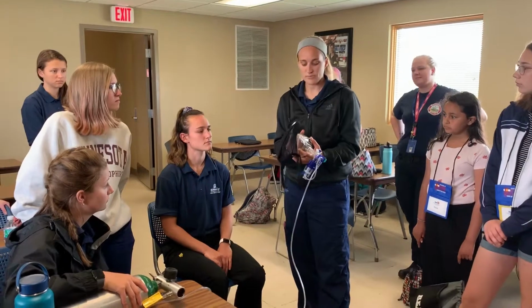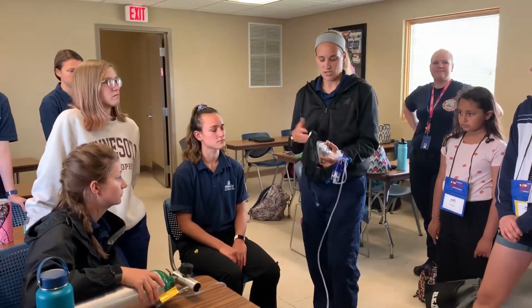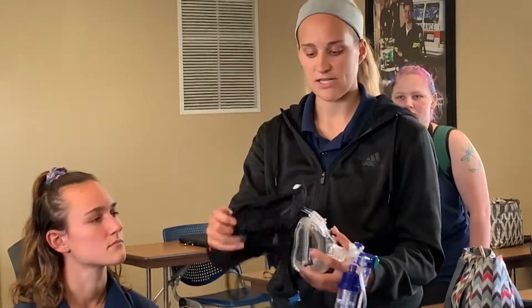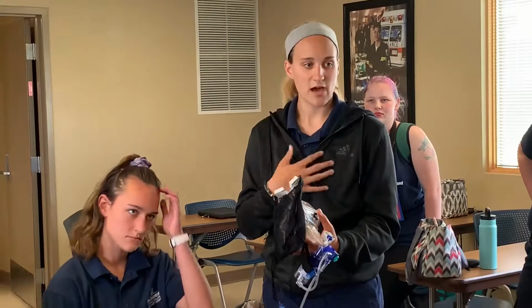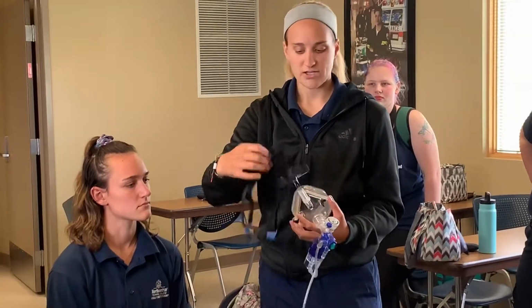So you want to make sure you're guiding them through the entire process and telling them what's happening. You'll use the idea that it's going to feel like you're in a wind tunnel, and then you'll tell them, I'm going to apply it to your face, and I want you to hold it for me. They'll hold it to their face and let the oxygen run for a little bit so they get used to the feeling of the oxygen being put into their body, and then you'll attach the mask to the back.